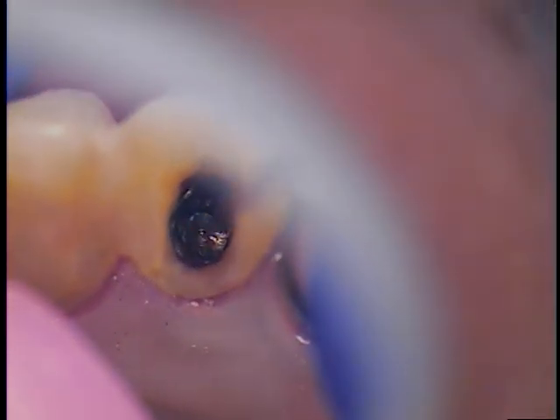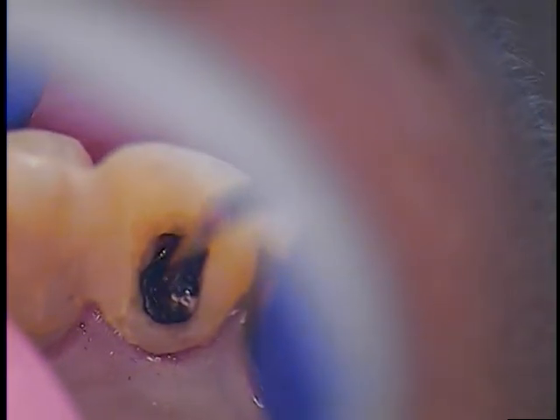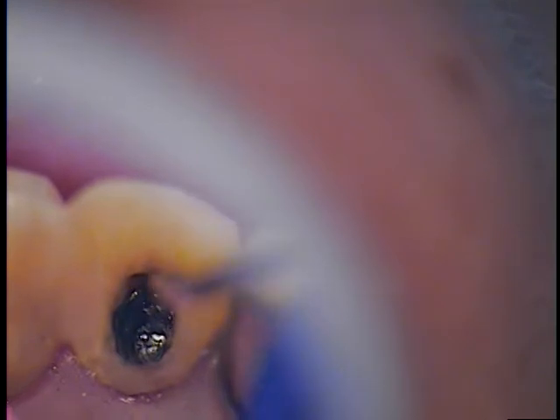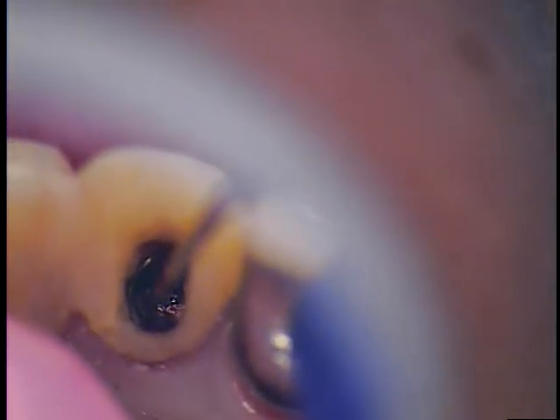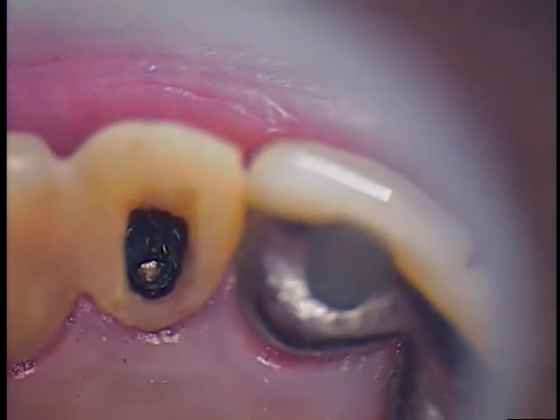You know, it could be the path holding this baby in there. Maybe just a little bit of the path. Let's see. At this point, it's a little lip. It might be a path issue. Alright, let's try to suction that out now. Perhaps a larger suction tip might be the answer. Here, a little more volume. Let's see.